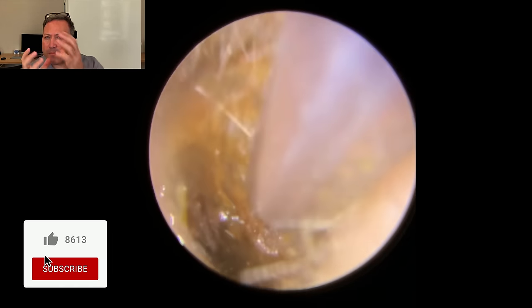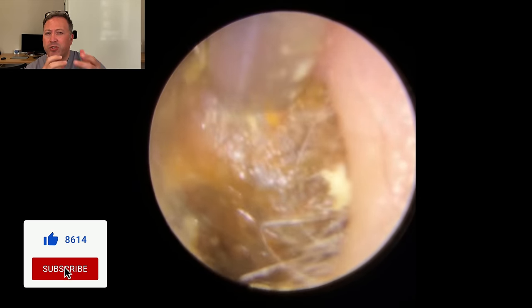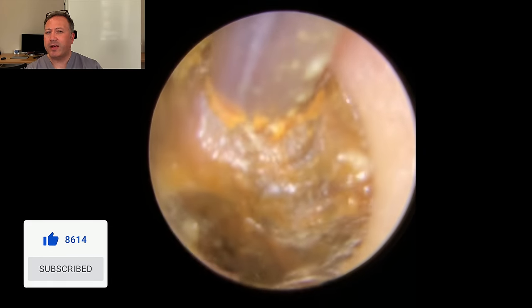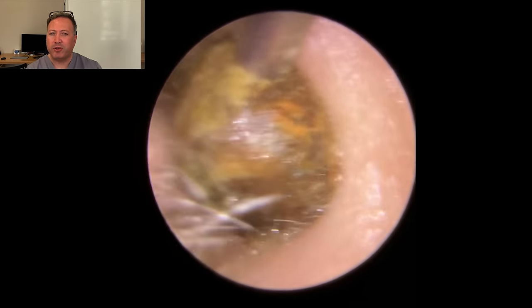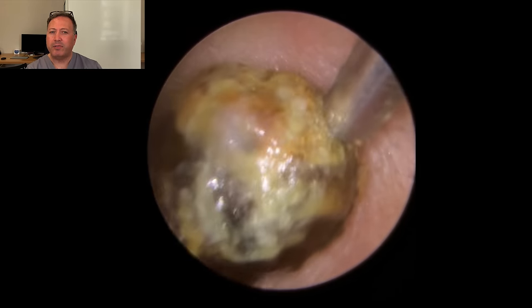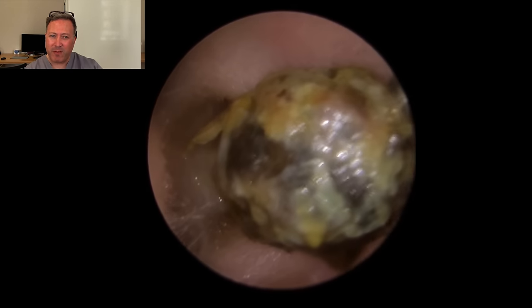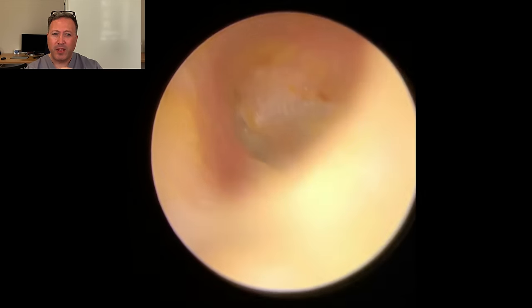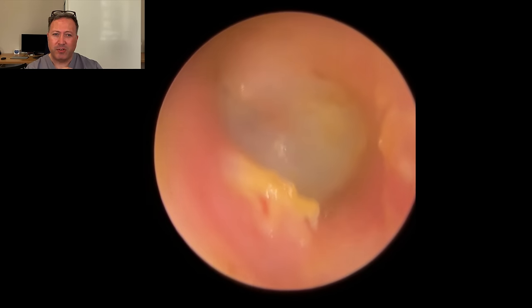It's almost like a little round ball of hard wax, this one. So we've just got it to the outside, we're just going to spin it over now to get to the softer wax underneath, which is going to give us a better grip with the suction. And there we are, out it pops. You can see the white skin debris there on the outside. It's almost a complete spherical block of wax, that one. And we'll take a look behind, you can see the eardrum there.